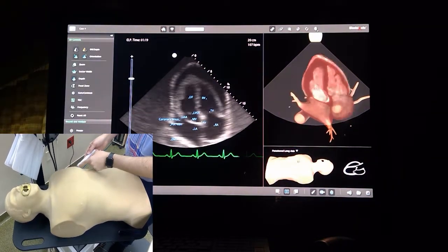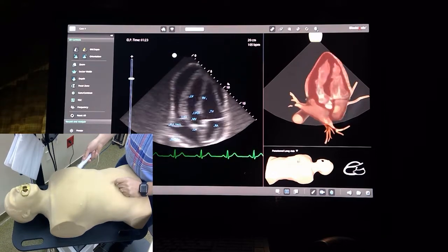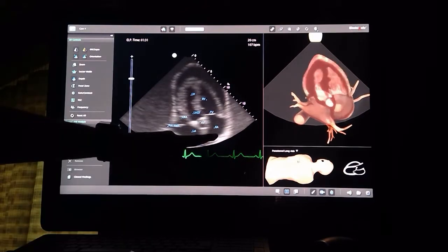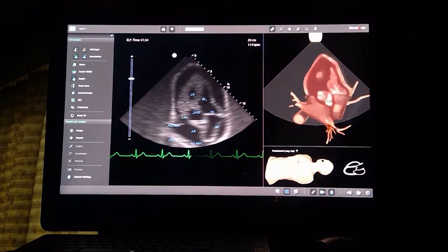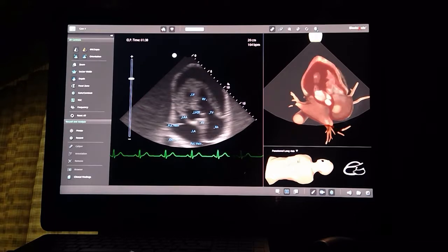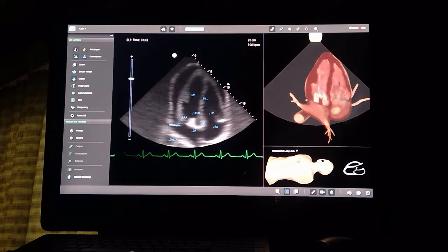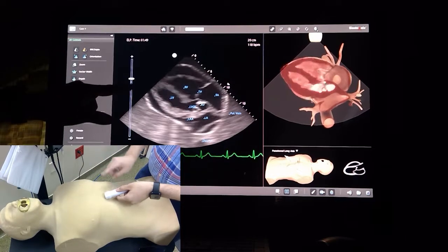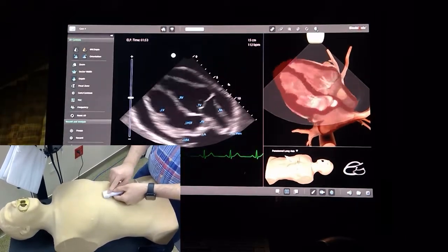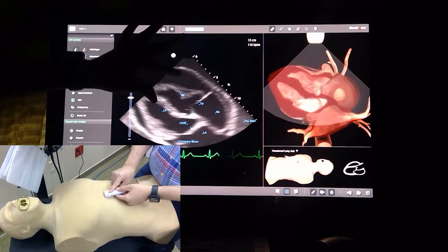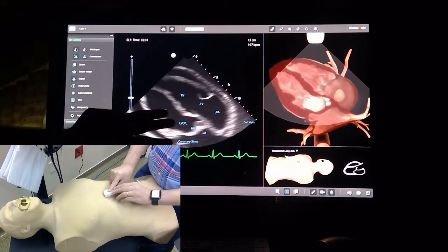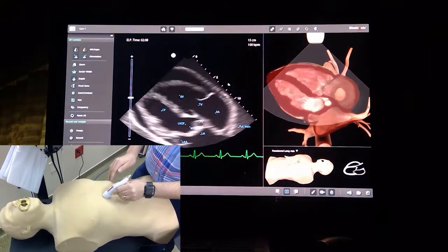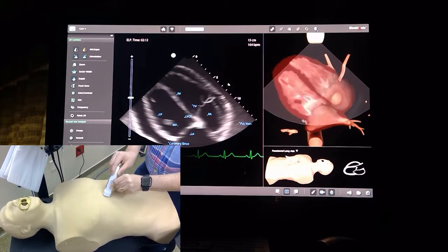On the apical four-chamber view with increased depth, we can see the heart swinging in a sack of fluid. Looking at the right atrium, it appears to be collapsing, most likely from the increased pressure of the pericardial fluid. In the subcostal view, when the ventricles are beating the right atrium is opening, but when the ventricles are relaxing the right atrium is collapsing.